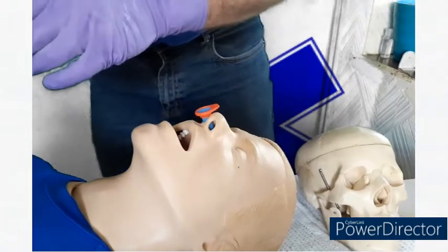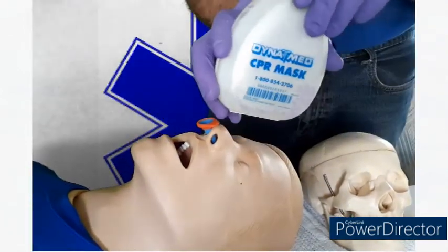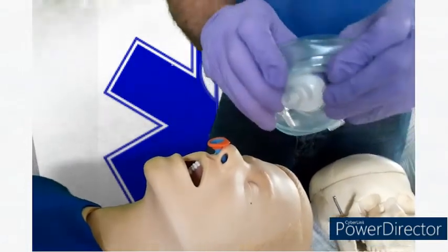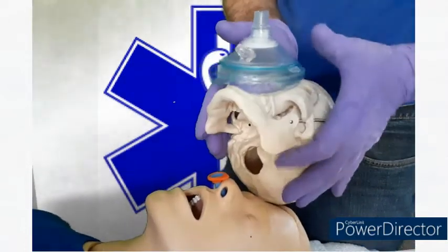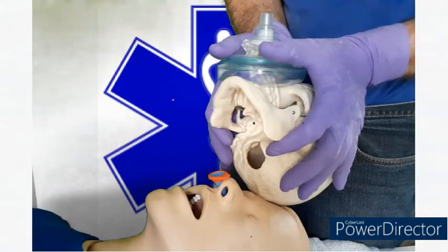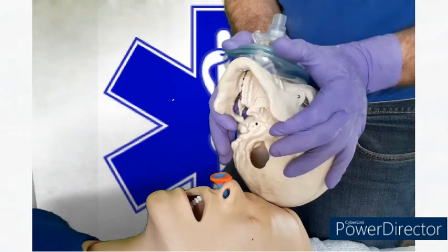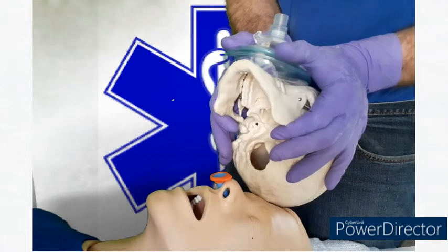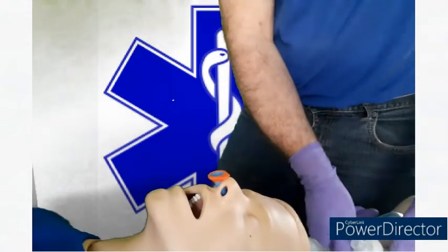This would be exactly the same as if you were using a traditional pocket mask on a patient, maybe for ventilation. So we would pop this out. This would then go over the top of the mouth and nose, both thumbs pointing towards the toes, index fingers under the angle of the jaw, pull the jaw into the mask so that you can ventilate them. And this is the gold standard for the two-person technique or for using the pocket mask to manage the breathing.